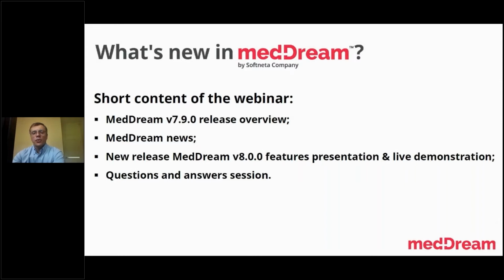Again, we will inform you about the MedDream news. MedDream news will also include all our media and web page, where you will get new insights on how you can search for news more easily and get informed proactively. And again, we will speak about our summer release, which we expect to come in 1 month.